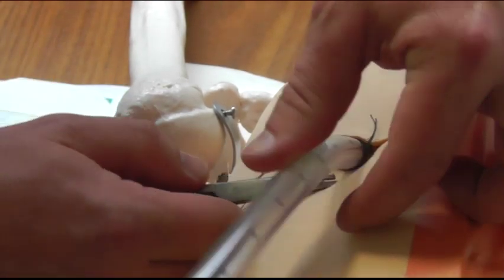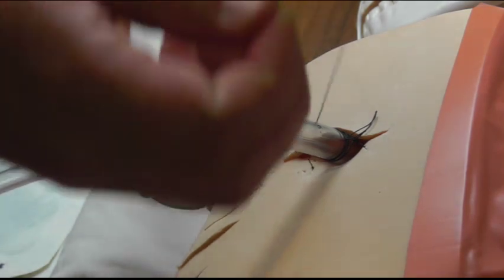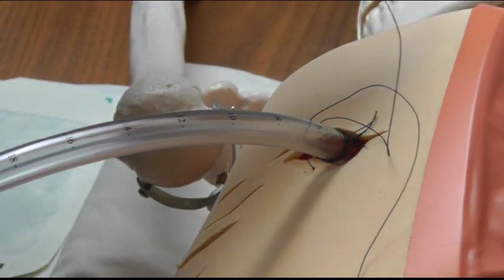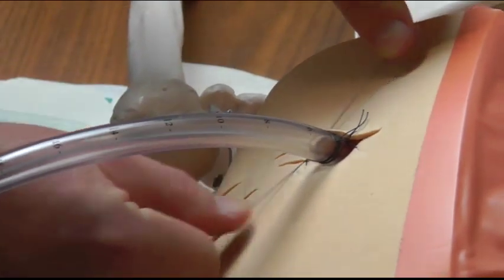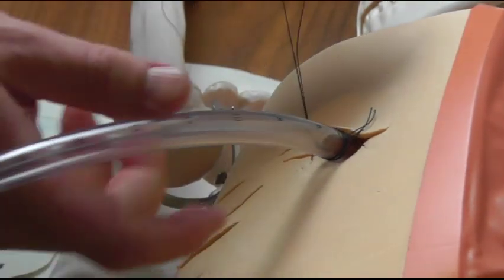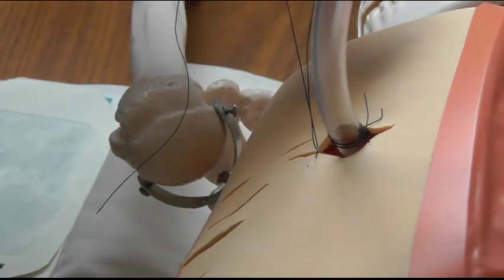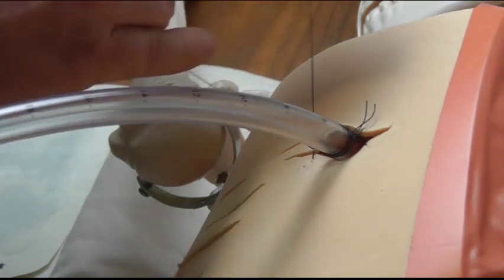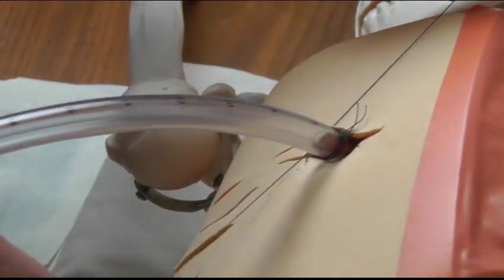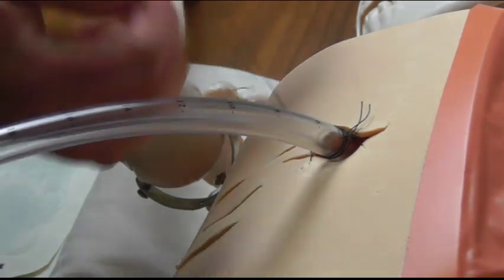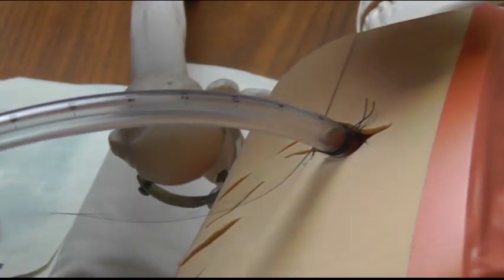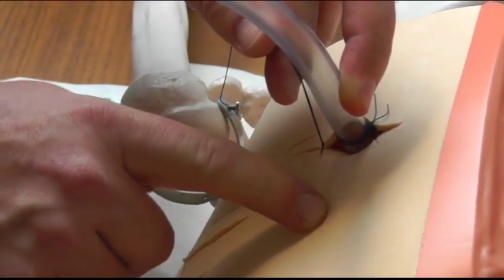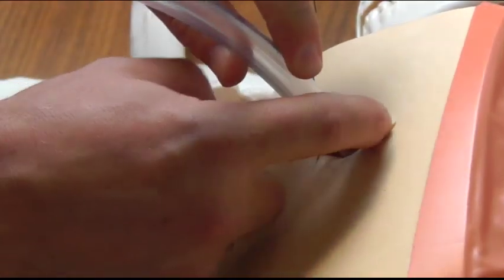You then go through the other side. Same length ends. You can then, like I said, cut the needle off if you like, or if you find it easier to tie your stitches with that. So you can see then that I'm making the wound fairly snug around the tube there. Looks a little bit artificial because it's this rubber material the chest is made out of. So then you've got another stitch there. So you can see the wound is now nicely opposed on both sides of the tube.